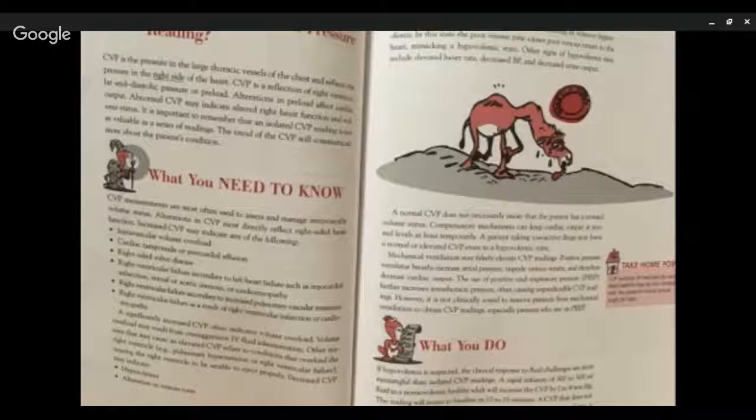However, it is not clinically sound to remove patients from mechanical ventilation just to obtain a CVP reading, because that's just a reading. The mechanical vent is their breathing, especially for patients who need positive end-expiratory pressure.